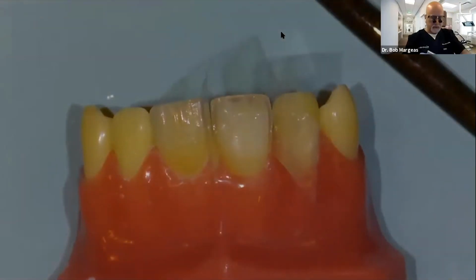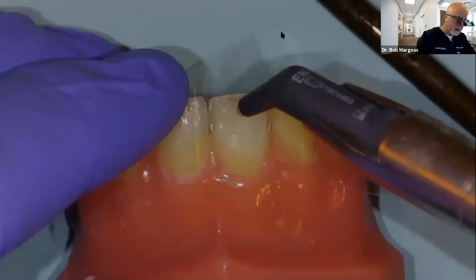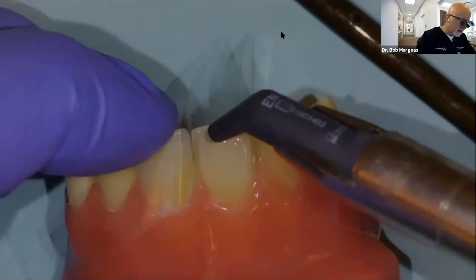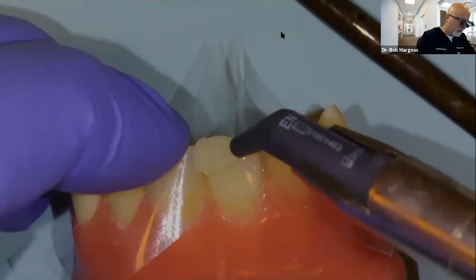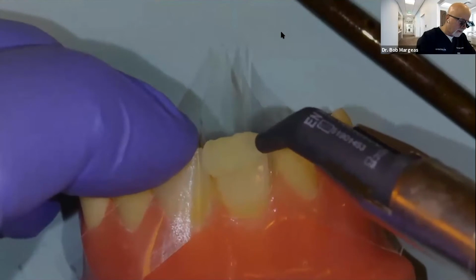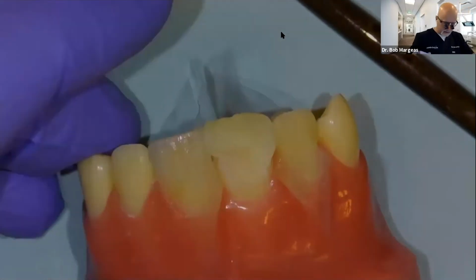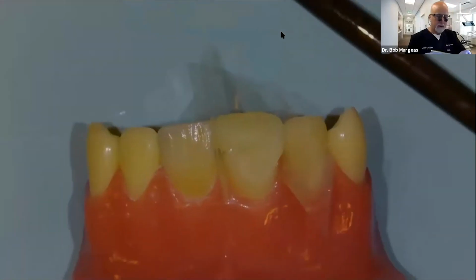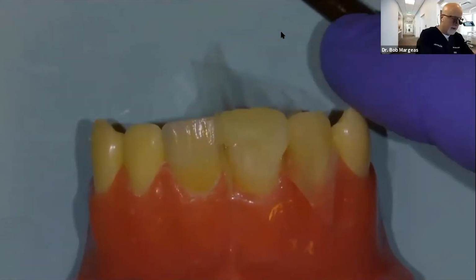And I'm going to place that in the interproximal and on the incisal. So I'm going to lay this here, and place that material like that. You can see from the incisal, I have that material here.